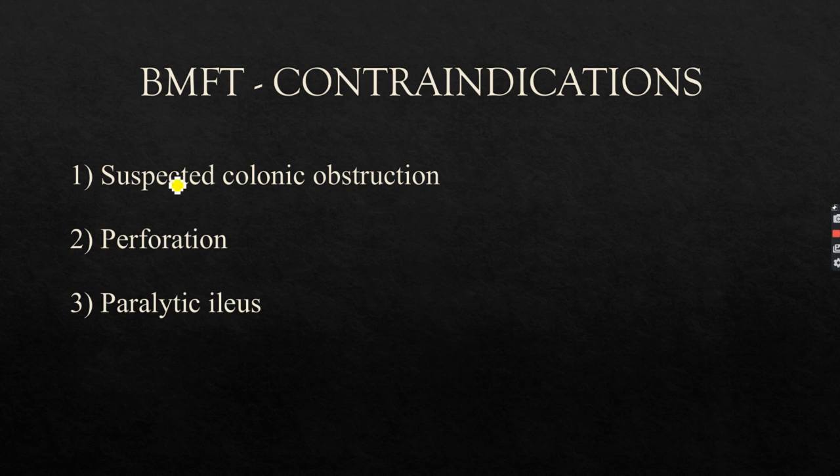It is contraindicated. If the patient has perforation or suspected perforation, don't do this BMFT. Or if the patient has paralytic ileus due to any cause, again in paralytic ileus, this BMFT should be avoided. These are the three important contraindications of BMFT. It looks somewhat like this.